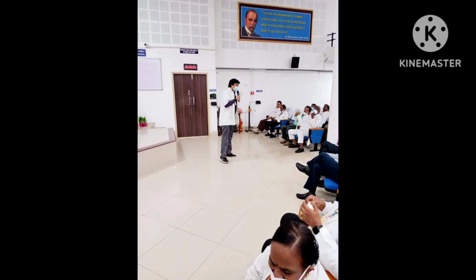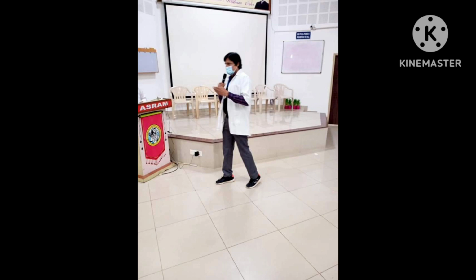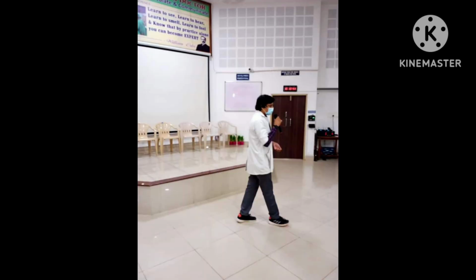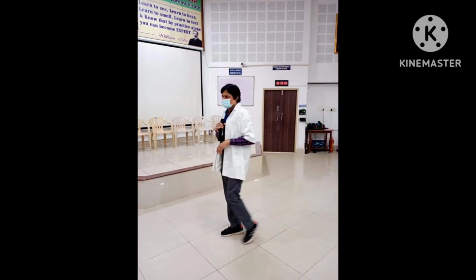This is always asked: the exact location of the IABP. It is 2 centimeters from the left subclavian artery. That's the answer.